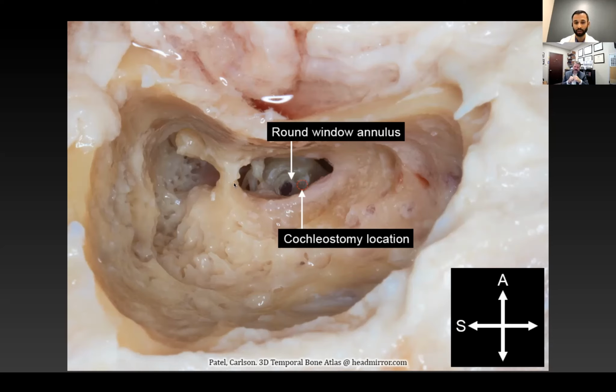So if you have a lot of bone high over the facial and a lot of bone on the ear canal, that aperture is very narrow. And so lowering those two structures will make the facial recess seem a lot wider than it is. A lot of times somebody will tell me, oh, this is just a narrow facial recess. It's usually not. It usually means that there's just too much bone over the facial or too much bone over the chorda.